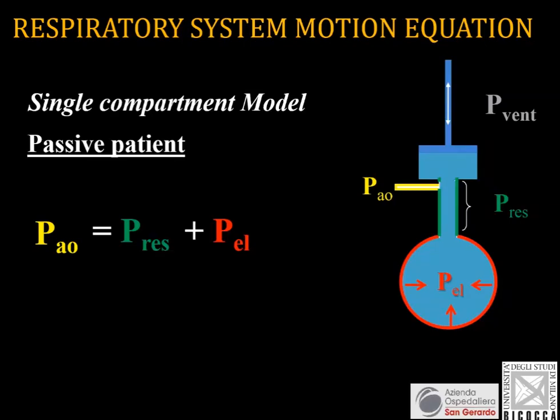So there is one aspect which is safety. But then the most important and the most valuable aspect of monitoring is the fact that we can actually gather much information on the status of the lung of a patient by ventilating and by reading the ventilator curves. So I always like to think of mechanical ventilation as a procedure which is at the same time therapeutic or supportive, if you wish, but also diagnostic.